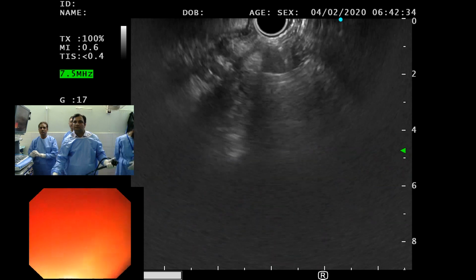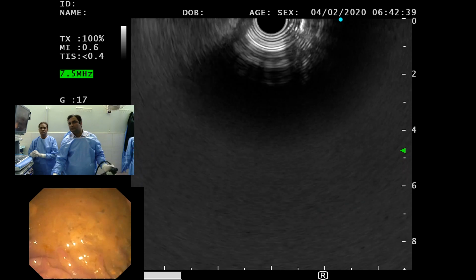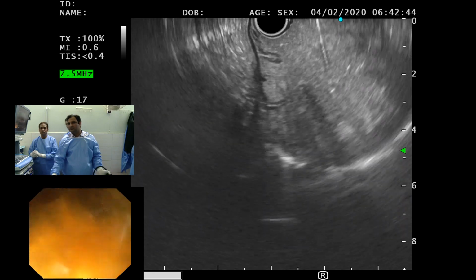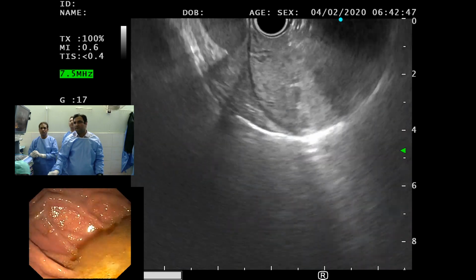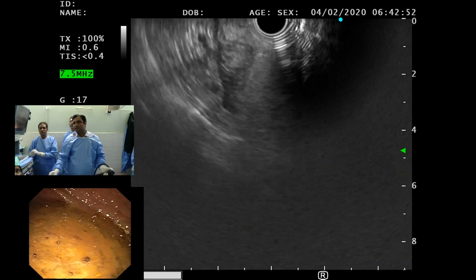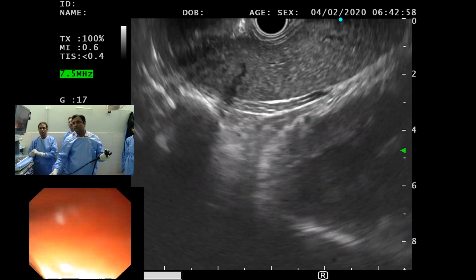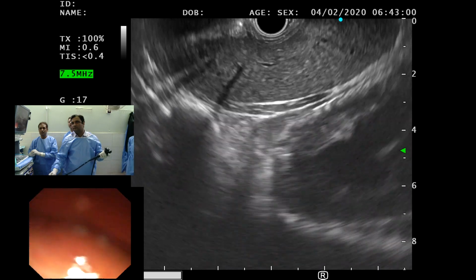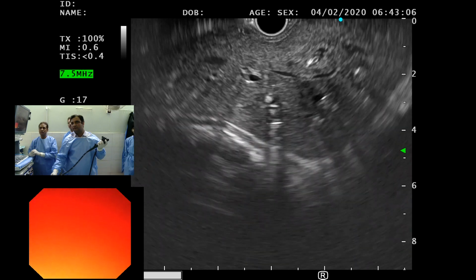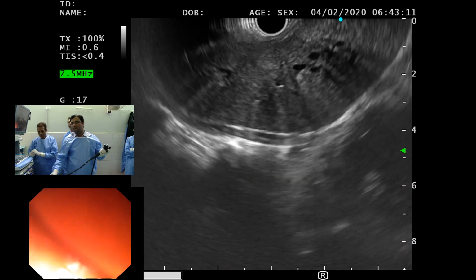One can see that there are certain erosions in the inner lining of the esophagus. Now, he has gone inside the stomach. This is the EG junction. At the EG junction, obviously, first, this is station number 1 where he has to make an inspection of the left lobe of liver, and he can have a look at the other segments of the liver as well. And then turning to the aorta at this junction and looking at the tail and body of the pancreas. Now, one can see that the ducts, the biliary channels are dilated.